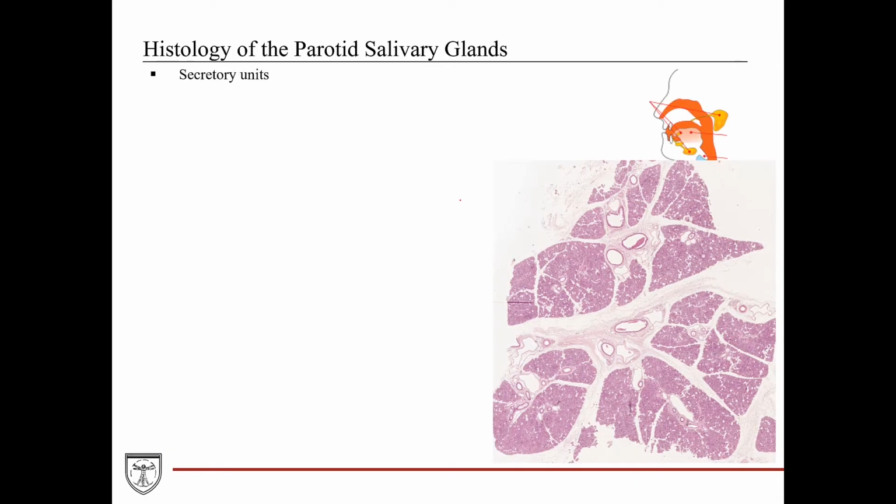Here's the parotid salivary gland, which is located right here, made a transverse section through an area, and this is what the parotid salivary gland would look like under the histology at macroscopic view. The secretory units of the parotid salivary glands are actually exclusively serous acini in composition, meaning the parotid salivary glands produce nothing but mostly watery fluids containing amylase and immunoglobulin A, and no mucin.